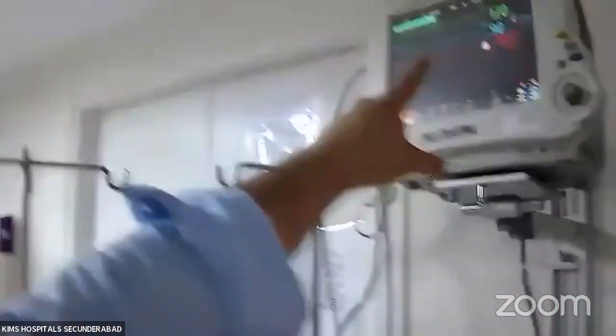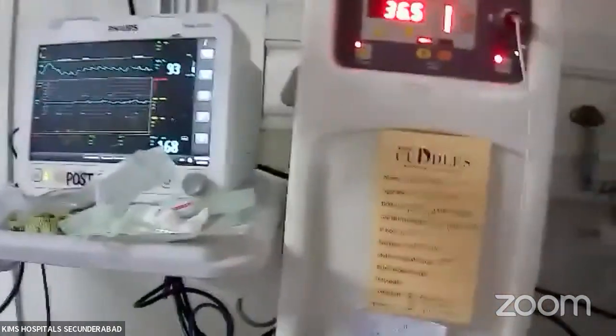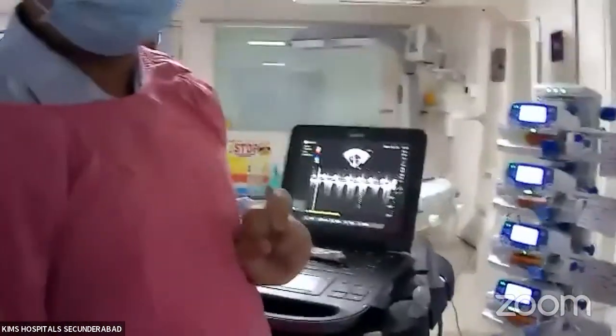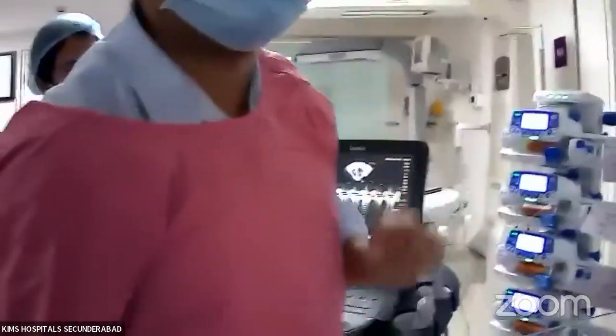And what is your systolic systemic pressure? Show there. So by all means, it's more than systemic pressure. If you see the upper saturation is 93 and the lower is also low, that means there is shunting. If the PDA is there, it is shunting right to left. Now you can measure the pressures are more than systemic, that means suprasystemic PA pressures.